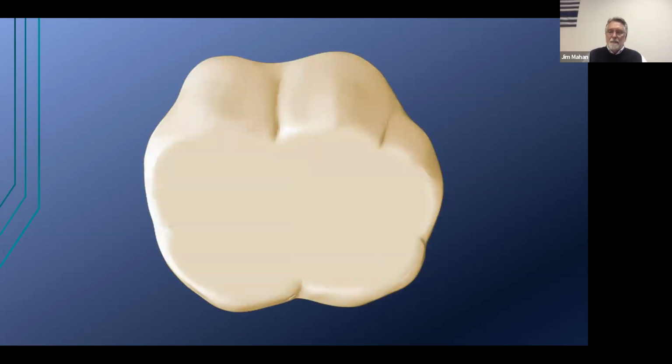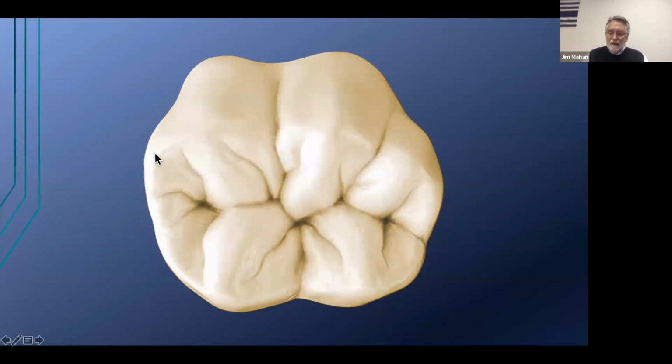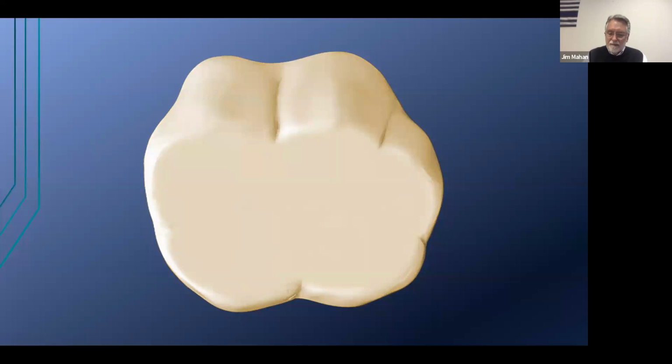Okay, here's the last tooth, and we're pretty much getting close to the time here. So let's just do this one. And for most technicians, this is the most difficult one. And it's going to go like this. Notice how this curves fairly dramatically. So this central groove guideline is going to have to be parallel to that, and it's going to curve the same way. Parallel means the same distance from one line to the other, equidistant.